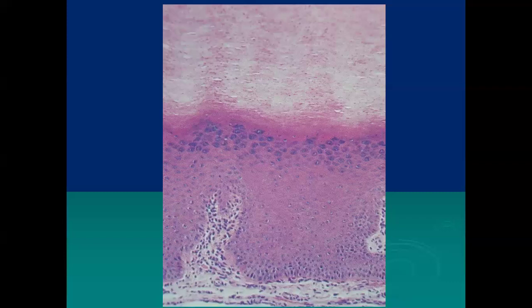Parakeratosis is associated with hypogranulosis or absent granular layer. So this is the difference between hyperkeratotic and papulosquamous or scaly conditions. In this histopathological appearance, in addition to hyperkeratosis and hypergranulosis, there is epidermal hyperplasia as well.